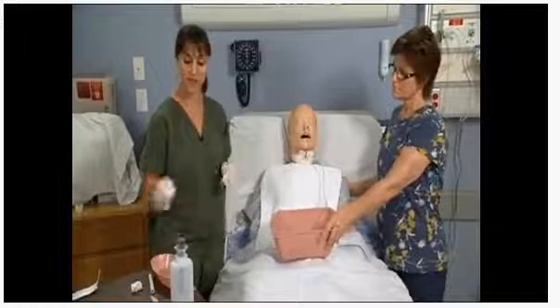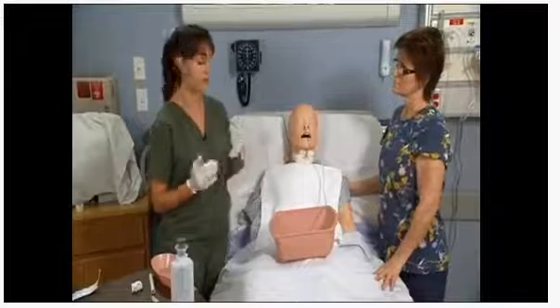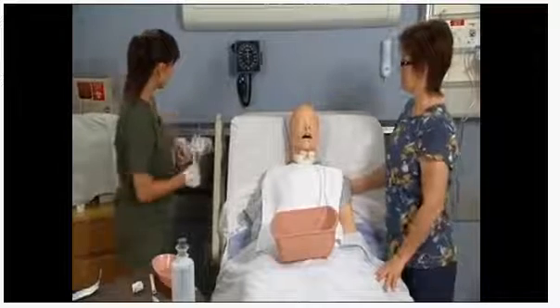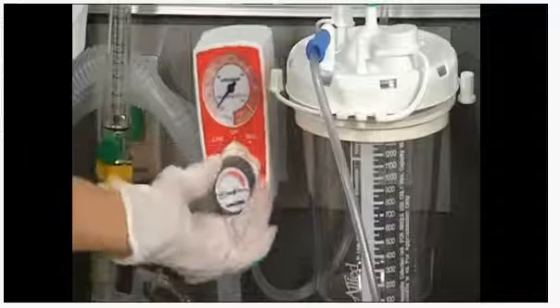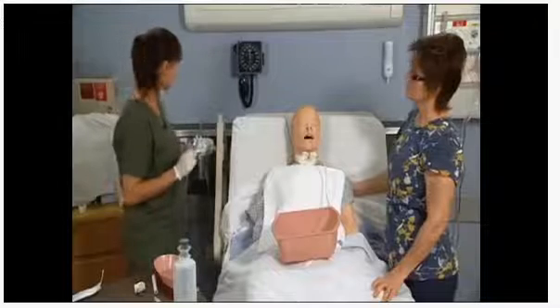Once I have assessed my pH strip, it's a 2, so I feel very comfortable that I am in the right place, then I'm going to go ahead and attach it to suction. I'm going to turn the suction on to whatever the doctor's order had said. With this doctor's order, it said attach NG tube to low intermittent wall suction, so that's what I'm going to put it on.